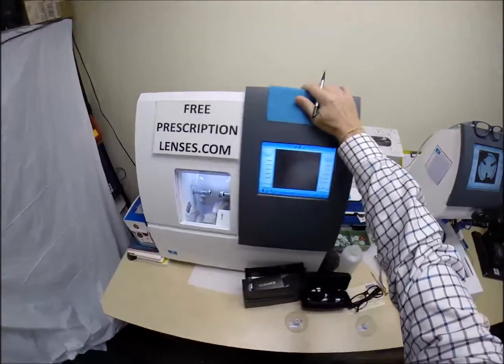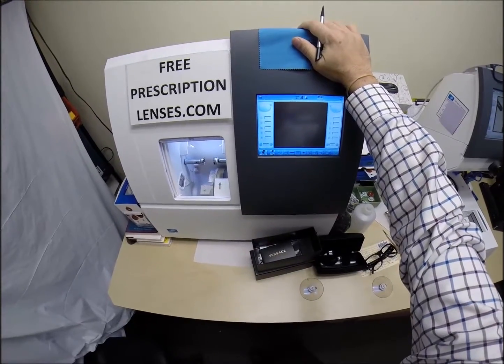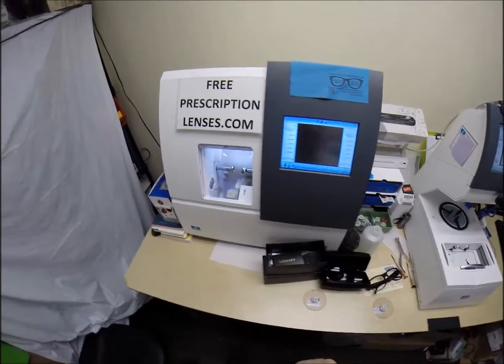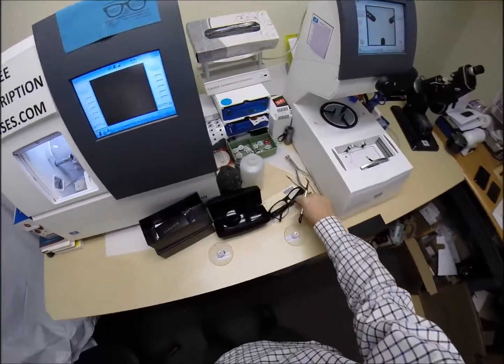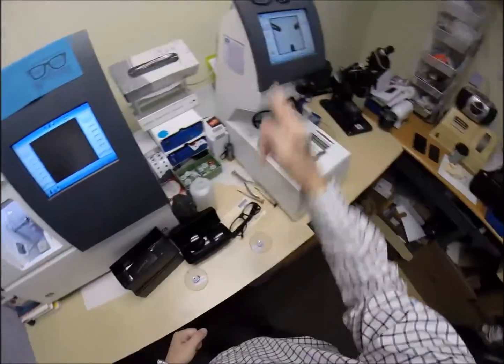We're going to come down here. This is the actual edger. This is what costs $40,000. It weighs 200 pounds. I recommend everyone go out, buy their own, put it on your kitchen counter. Then you can cut your own Versace lenses at home. You won't need this guy anymore to mess up and do it for you.